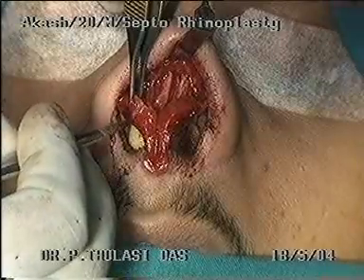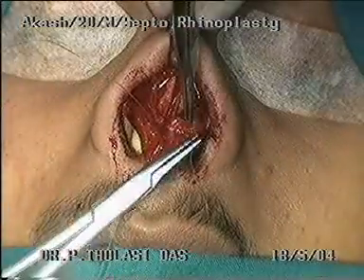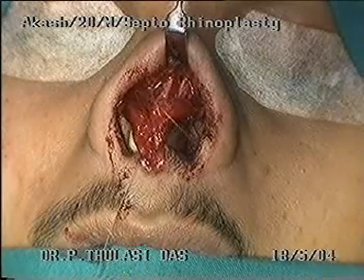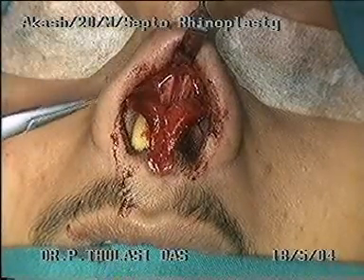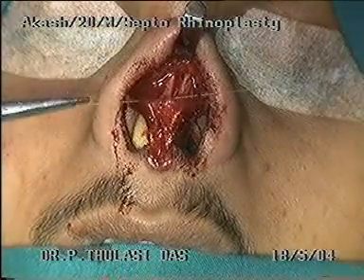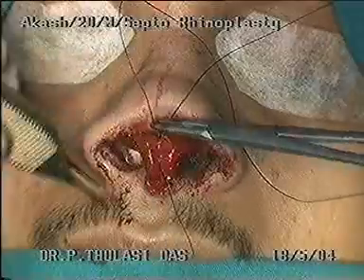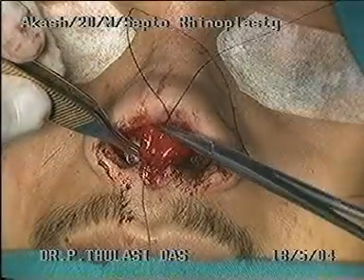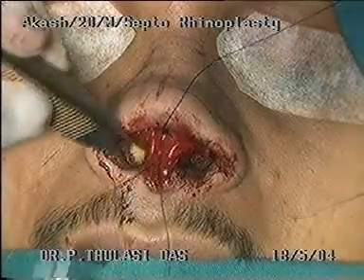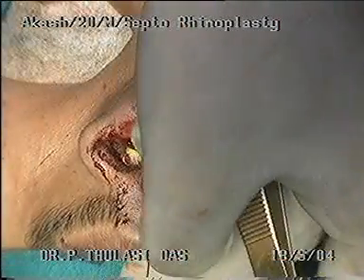A modified Goldman tip procedure is done to lengthen the medial crura. By changing the position of the angle between the medial and lateral crura, the columella can be lengthened. A silk traction suture is placed over the cartilage and brought out through the membranous septum. By pulling on the silk suture, the cartilage can be pulled to a forward position.